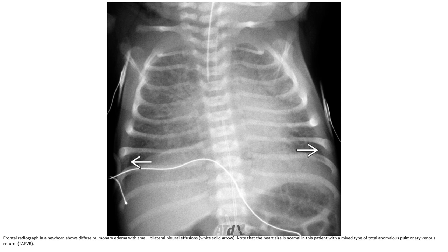This is the first example chest X-ray in a newborn. It shows pulmonary edema with small bilateral pleural effusions. Note that the heart is normal in size in this patient with a mixed type of total anomalous pulmonary venous return.